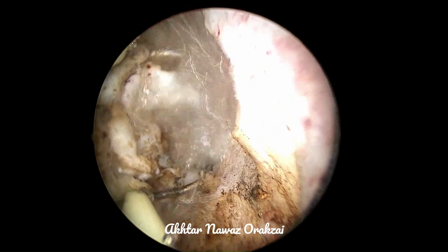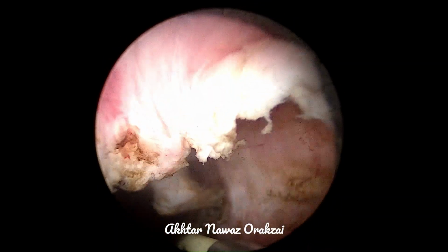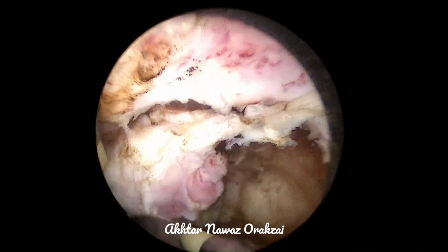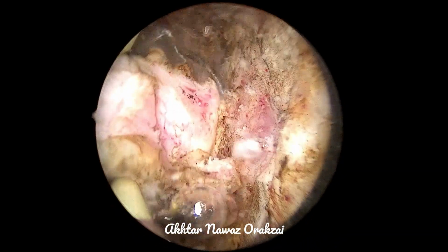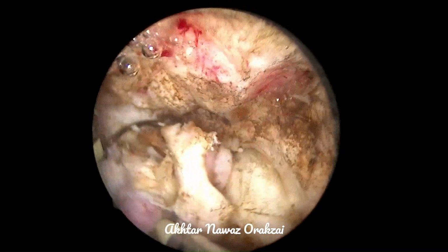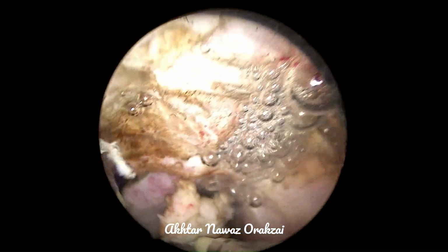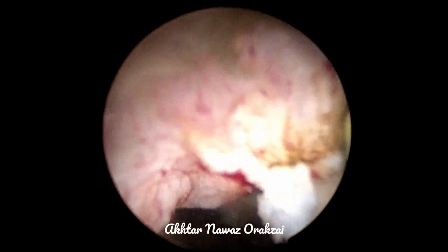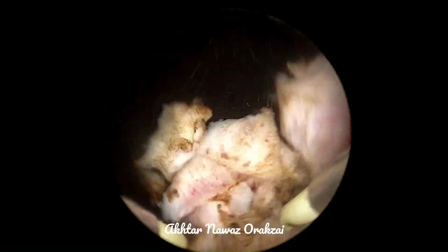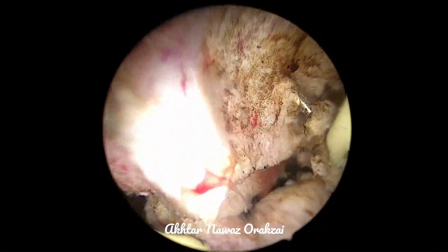Here you can see that I am taking superficial chips and I am pushing, coming towards the urethra and then pushing the prostatic tissue into the prostatic cavity and then resecting in order to, number one, prevent incontinence of urine, and number two, prevent bulbar urethral stricture, because the more distal you come with diathermy, the more are the chances of making post-operative bulbar urethral strictures.